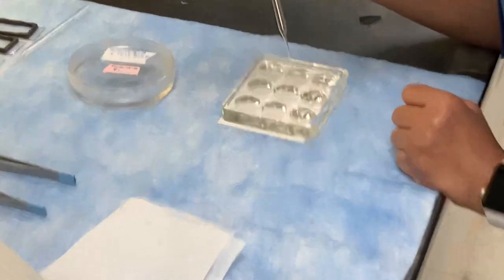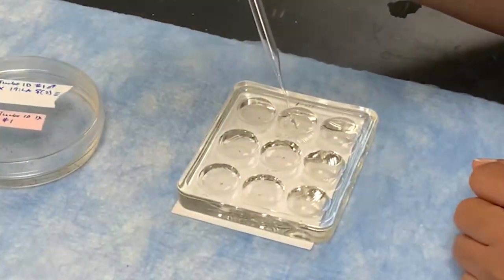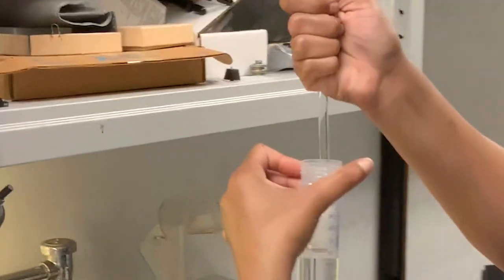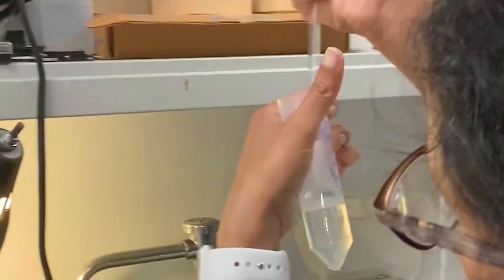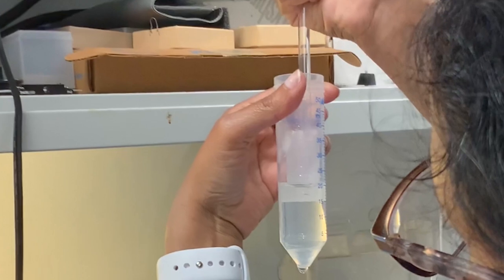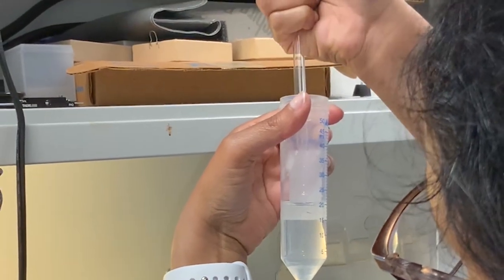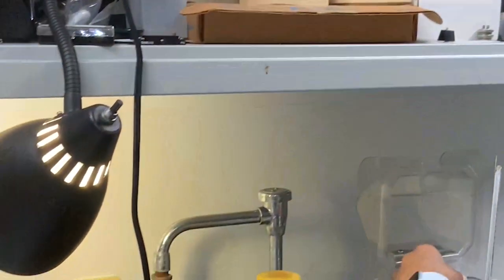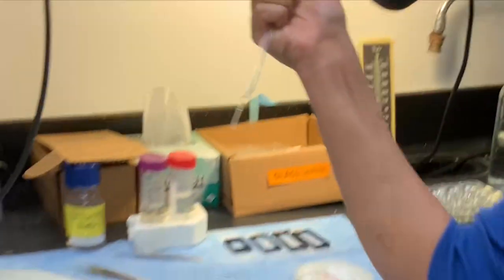We start by embedding the zebrafish larvae in small drops of low melting point agarose. The embryos are briefly immersed in the melted agarose. Then a small drop with the larvae is placed in a custom-built imaging chamber.